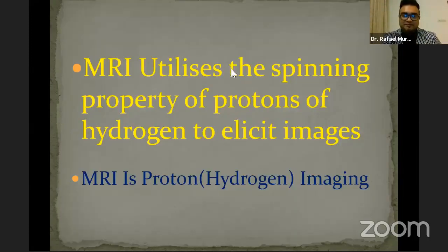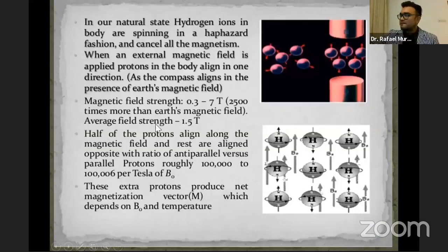Sir, next slide, please. So MRI utilizes the spinning property of protons of hydrogen to elicit the images. So basically MRI is a proton imaging. So next slide, please.